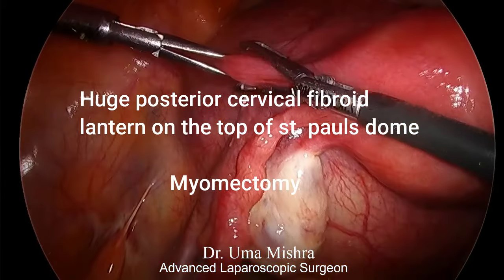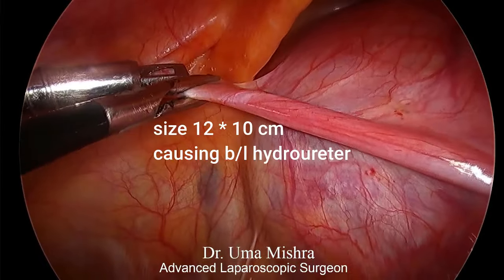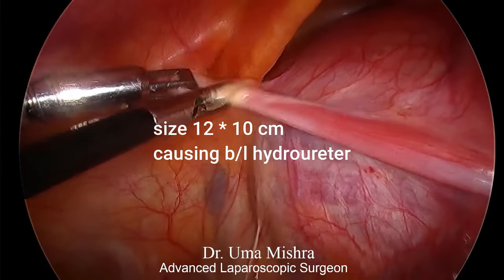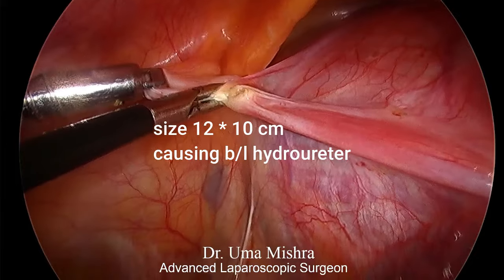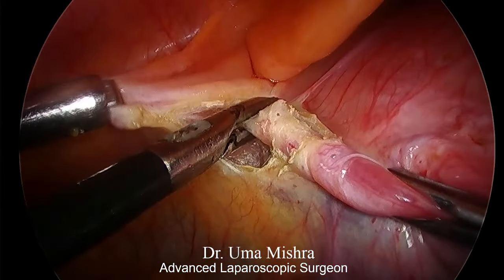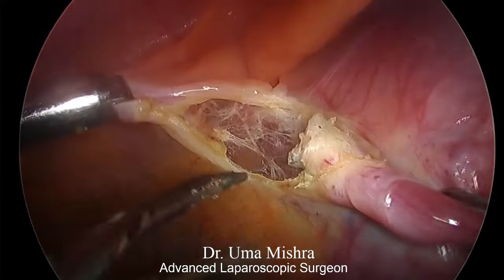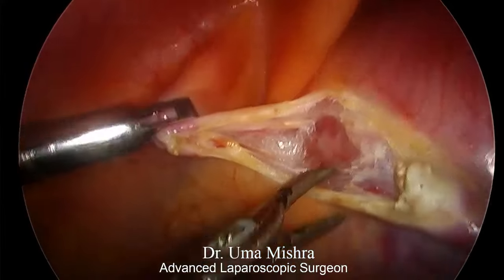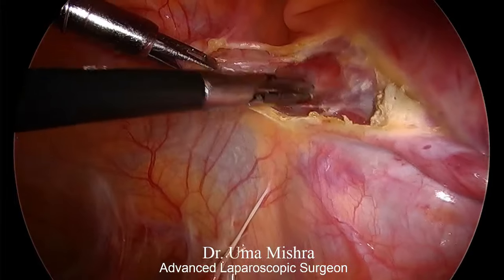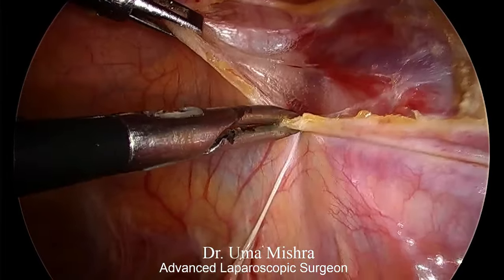Uma. Today I am going to present you a case of posterior cervical huge size fibroid. The size is approximately 12 cm in length and 10 cm in width. So we are going to perform laparoscopic myomectomy. The appearance is also called lantern on the top of St. Paul's dome.